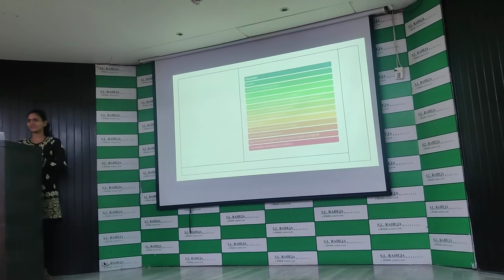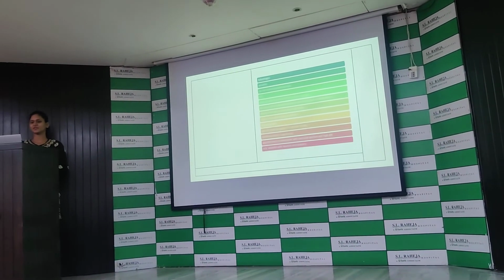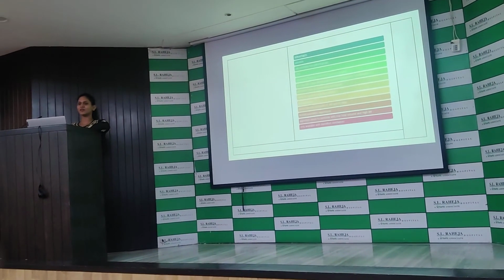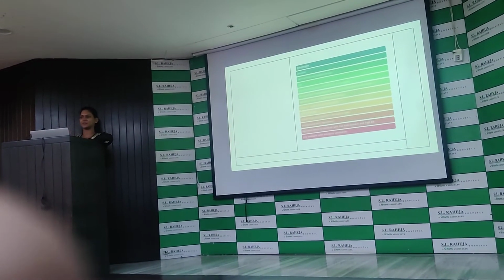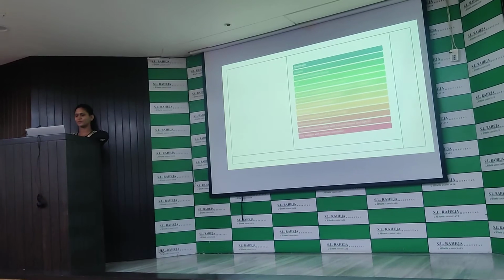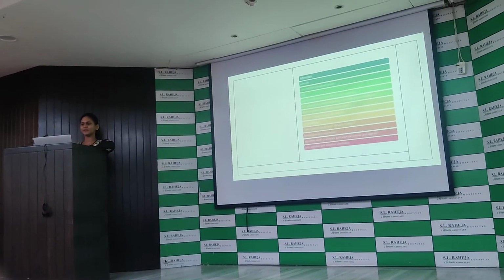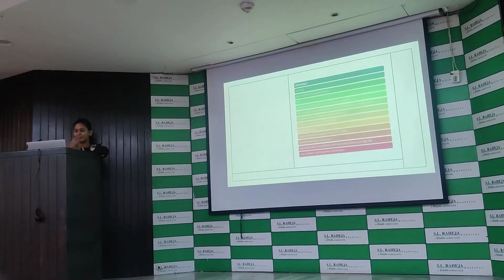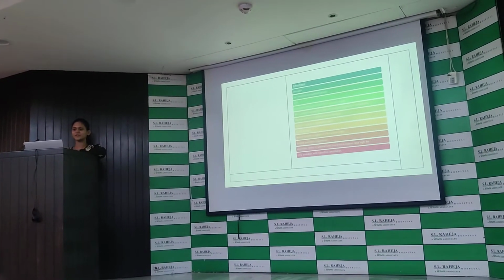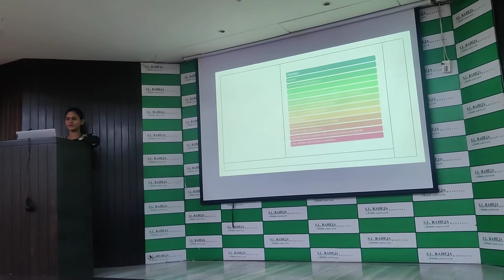So the advantages are that it's versatile. You can ventilate any patient in a safe manner. It prevents tachypnea, auto-PEEP and dead space; it will always keep the patient in the box. It is less operator dependent, with less need for operator involvement. It decreases the time on mechanical ventilation and adjusts to the patient according to their inspiratory effort.